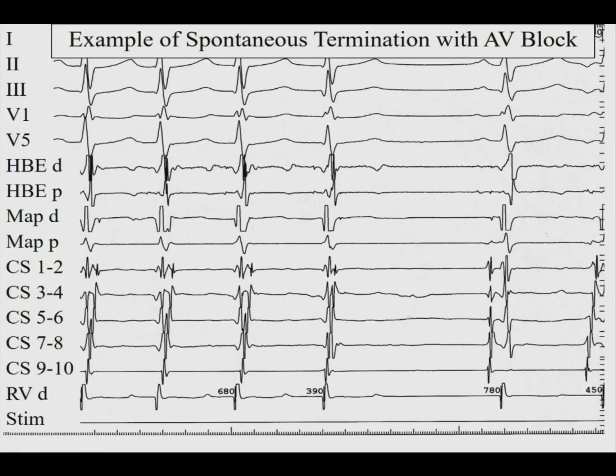So this is diagnostic. You could just go ahead and ablate, but you don't want to. You want to make sure you reproducibly can induce a tachycardia, that you fully understand what the baseline is before you go turning on the RF and delivering RF, because if you don't have a good endpoint, then you're not going to know when you're done. So the toughest cases are cases where you've induced a tachycardia once. For AV nodal reentry, the fast and slow pathways are so similar that you have difficulty inducing tachycardia, and if you induce it once, you do a slow pathway ablation, you get junctional ectopy, your endpoints are difficult. So unless you completely eliminate the slow pathway, it's hard to know if you're done.